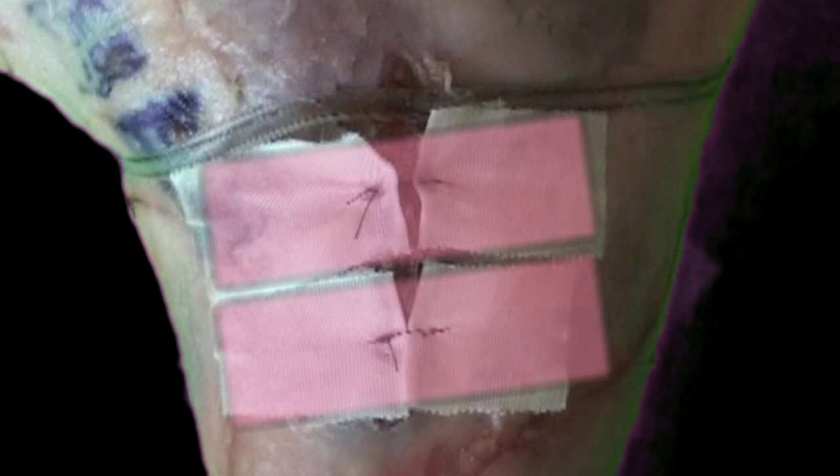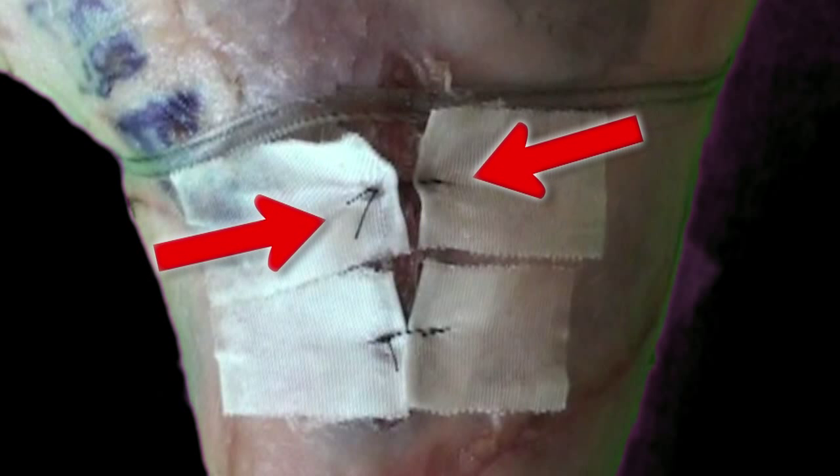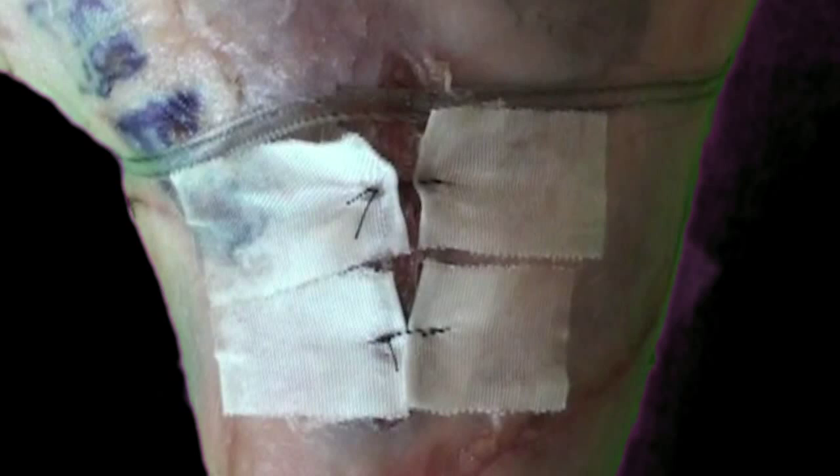This is especially useful for patients who need a wound closed over several days, because each time they return you can put another suture through the same tab and apply more tension each time, bringing the wound margins closer and closer together on each subsequent visit.